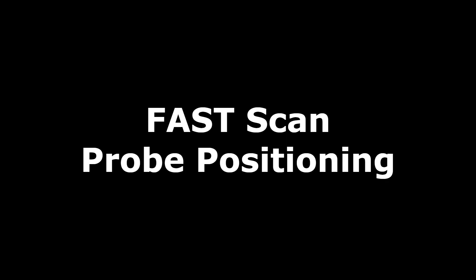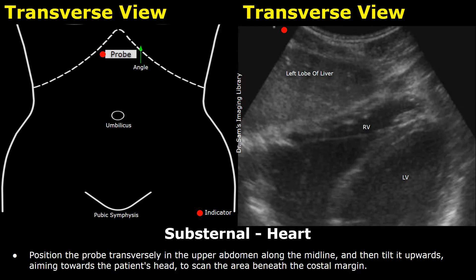Hello everyone, this is Dr. Sam, and this video is about FAST scan ultrasound probe positioning. FAST stands for Focused Assessment with Sonography for Trauma. It is an emergency ultrasound scan performed in the setting of accidents and trauma. It is a quick scan.